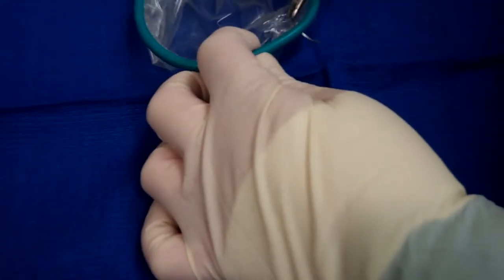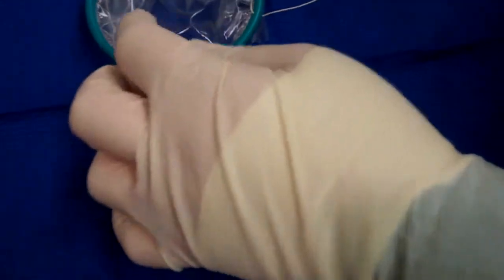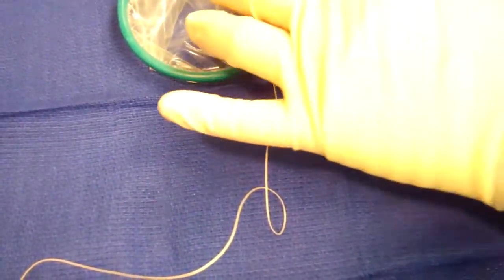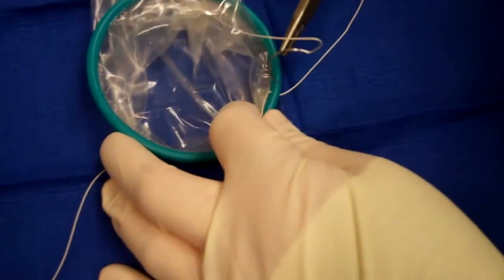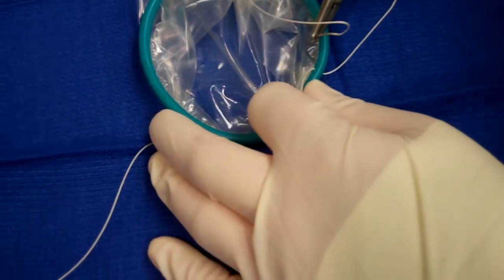Beautiful. And we'll do a figure of eight is what we'll do. So she'll go right back through it, right not through the same hole, but right next to it. And I'll have her do a figure of eight. And it's good to make the needle go away from the center. That's how we make a tether. Beautiful. That's perfect, Brenda. That's like perfect. So we're gonna do away from the center.